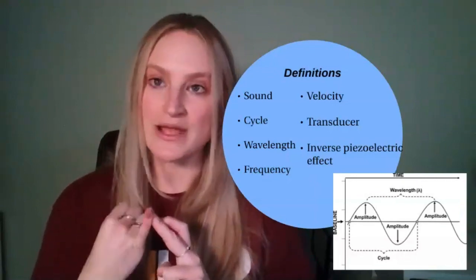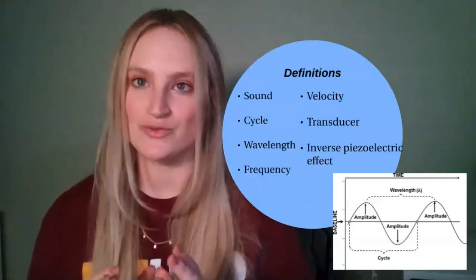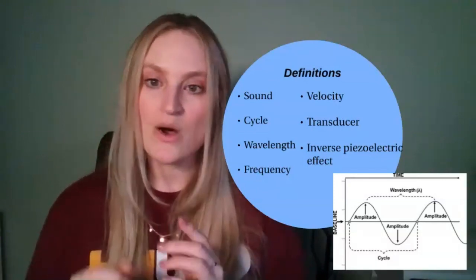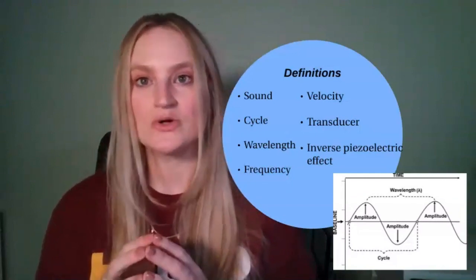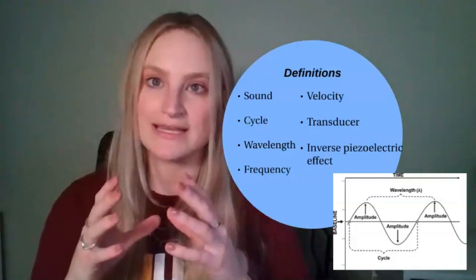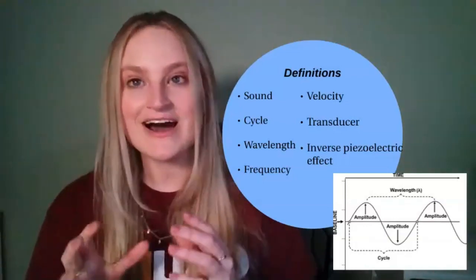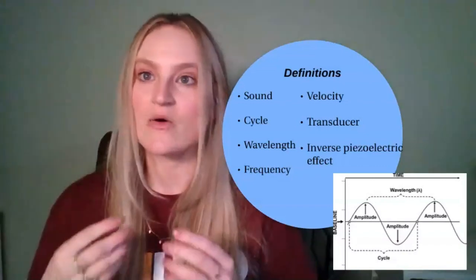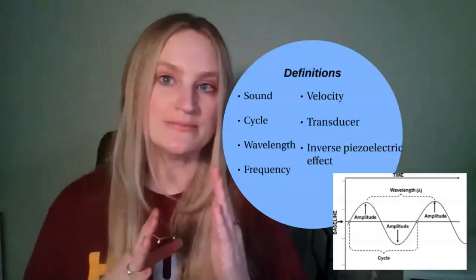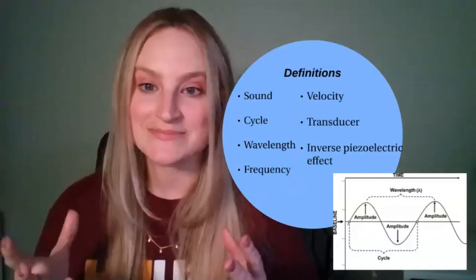Sound is a series of pressure waves propagating through a medium. This sound travels as a mechanical longitudinal wave in which particle motion is parallel to the direction of wave travel. One cycle of the acoustic wave is composed of a complete positive and negative pressure change. The wavelength is the distance traveled during one cycle. The frequency of the wave is measured in cycles per second, or hertz. Velocity is the speed at which a sound wave travels through a medium and is also called propagation speed. It is measured in meters per second.